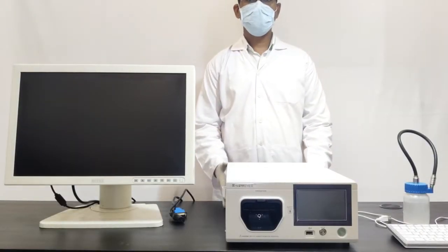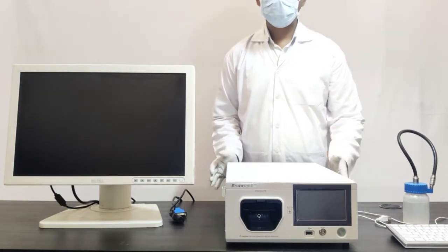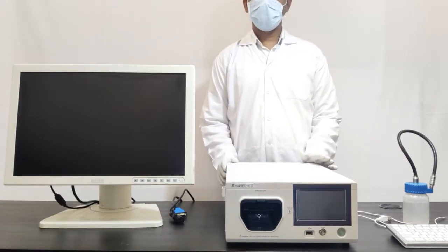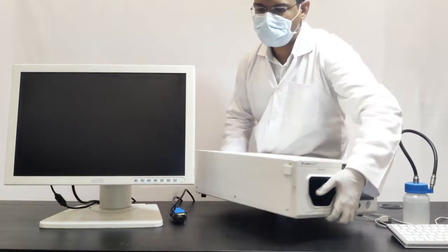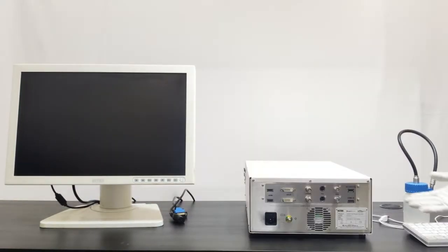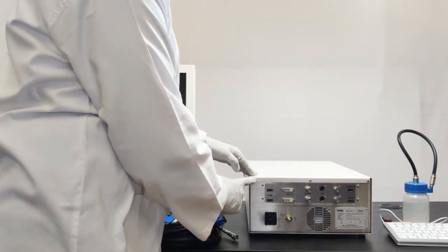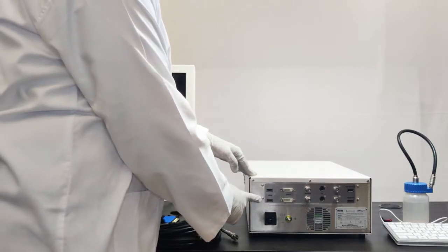Here we see a concrete setup of the SmartEye II Plus video processor system. This is the rear panel of the SmartEye II Plus video processor. These are the video outputs.